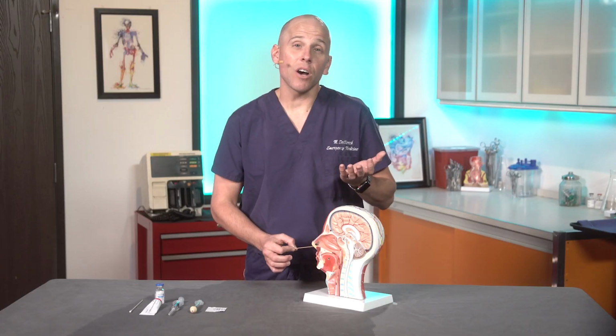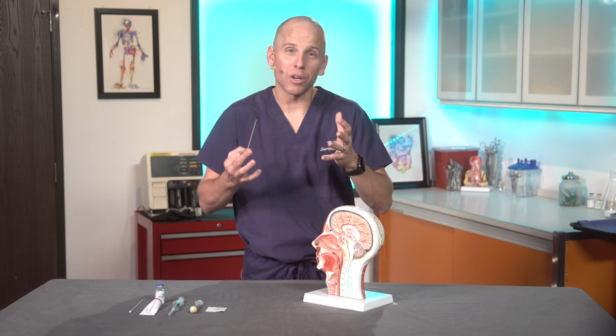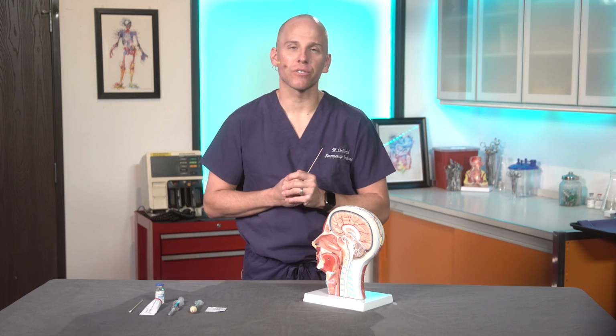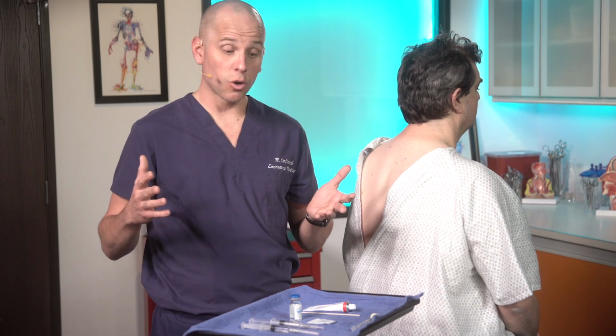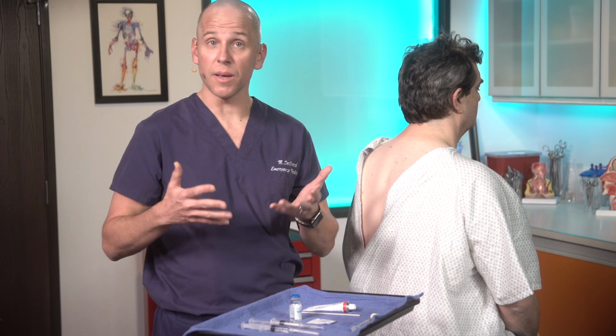Okay, so now that we know where we're going to be doing our nerve blocks and our trigger point injections, let's move on to how to actually do these procedures. All right, so now that we have our patient and we're ready to do our nerve blocks and trigger point injections, let's quickly review our equipment tray. And thankfully, this is a very simple equipment tray.